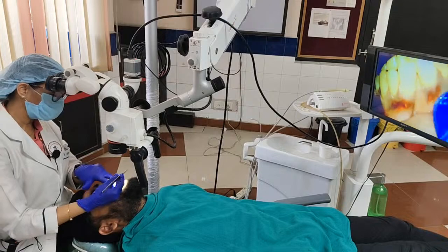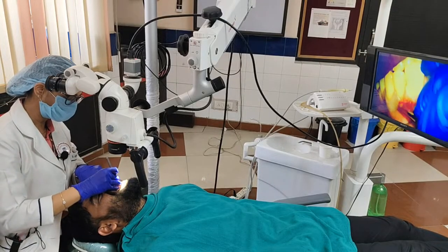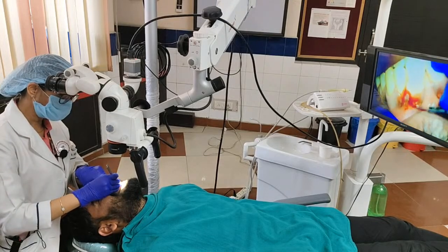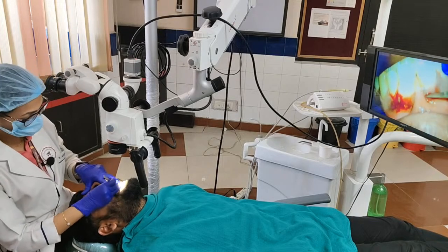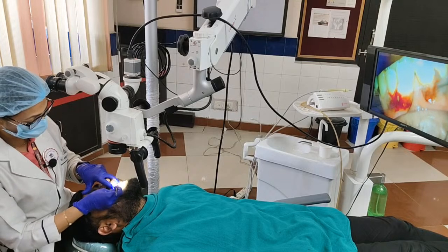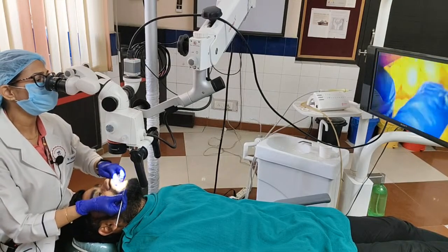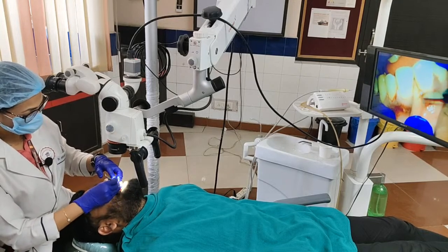So there are different methods. You could even do it with burrs. We have a PG in our department who is doing her research on that. She's working with a CeraBurr. A CeraBurr is going to remove the pigments through epithelial abrasion. You can do it by burr method, or by scalpel method. The laser method you will be seeing in the afternoon. Probably if we have enough patients, we will get our hands on that also.